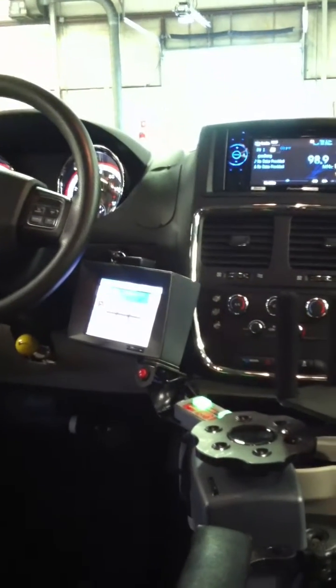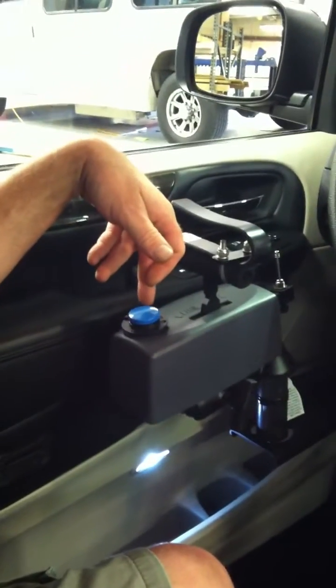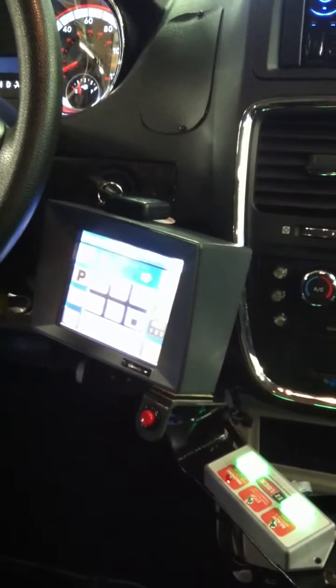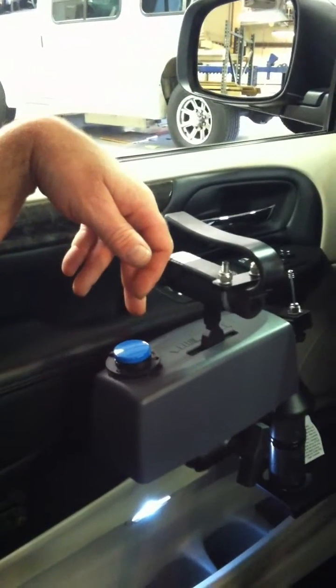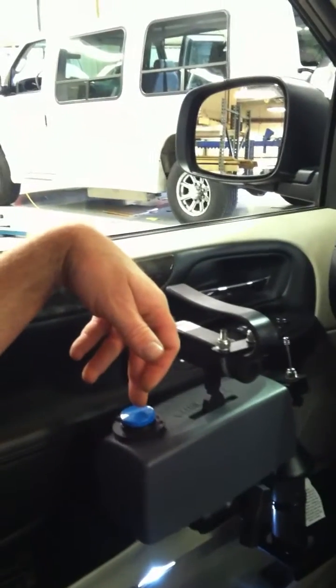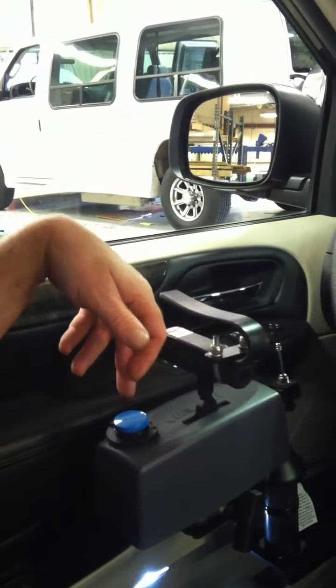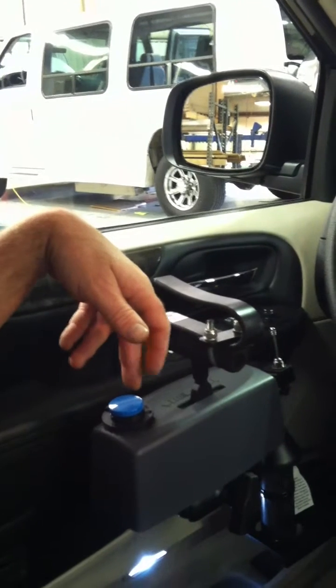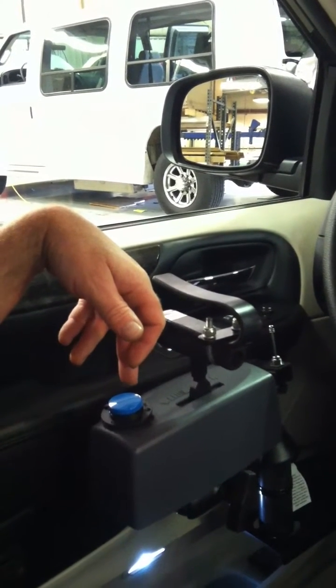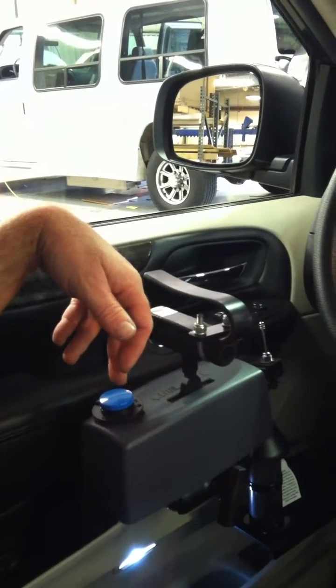This also has Digitone, which you can operate several functions with one switch. Number two is right turn, number three is left turn, number four is horn. You can do six functions with one button.